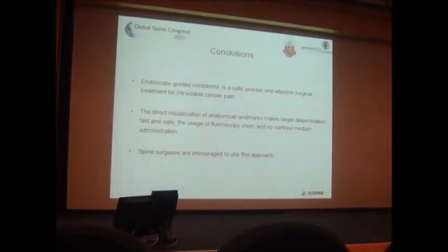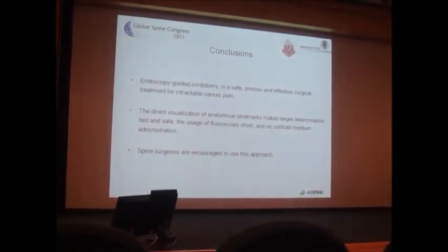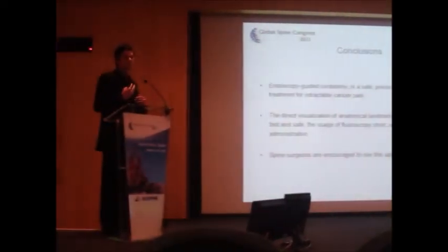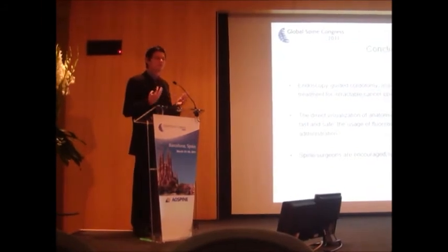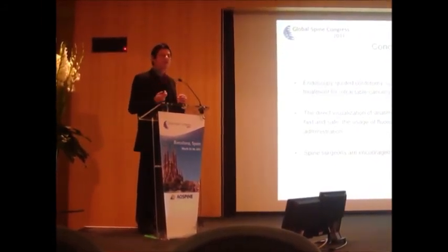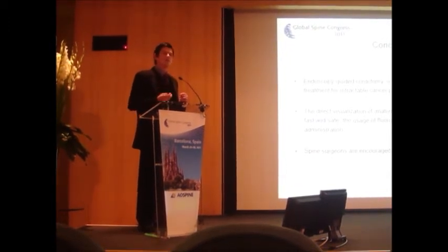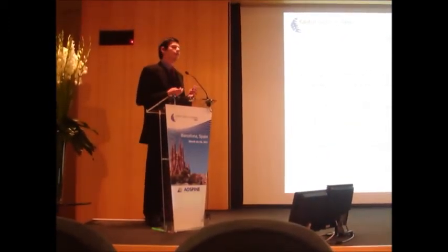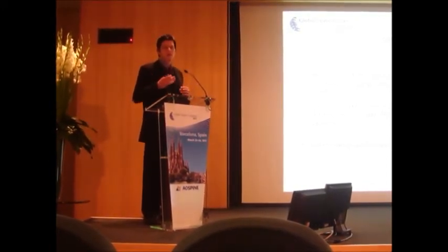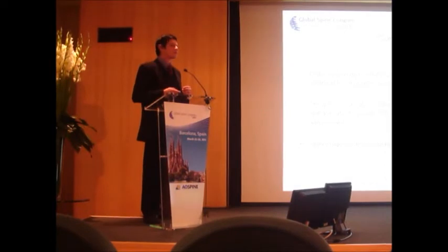We would like to encourage spine surgeons to use this approach. It is also open now to do this kind of intradural percutaneous procedure, even to do biopsies or to introduce a small endoscope of 0.8 to 0.9 millimeters in the sacral roots, or to do biopsies of tumors.